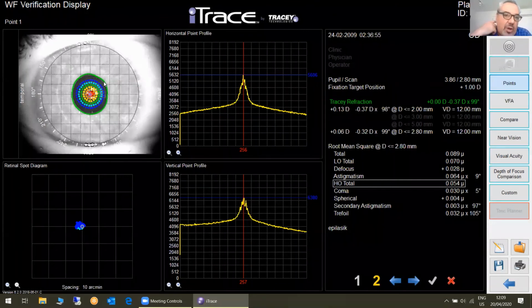Now, if you have a myopic eye, that's no problem, because those eyes are long and the visual axis will most probably be in the middle of the pupil. But hyperopic eyes have a visual axis that is decentered nasally. And if you think about it, now you know, with all those 20 years of experience, that when people do LASIK, they say the myopes, they're easy.